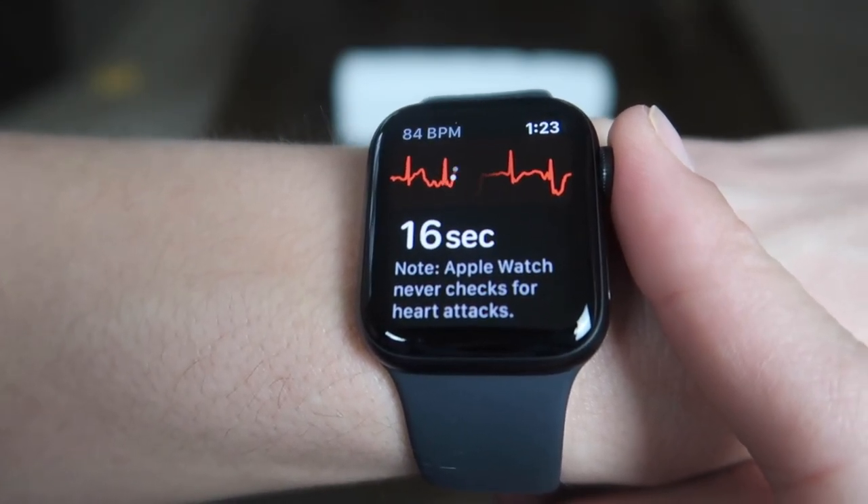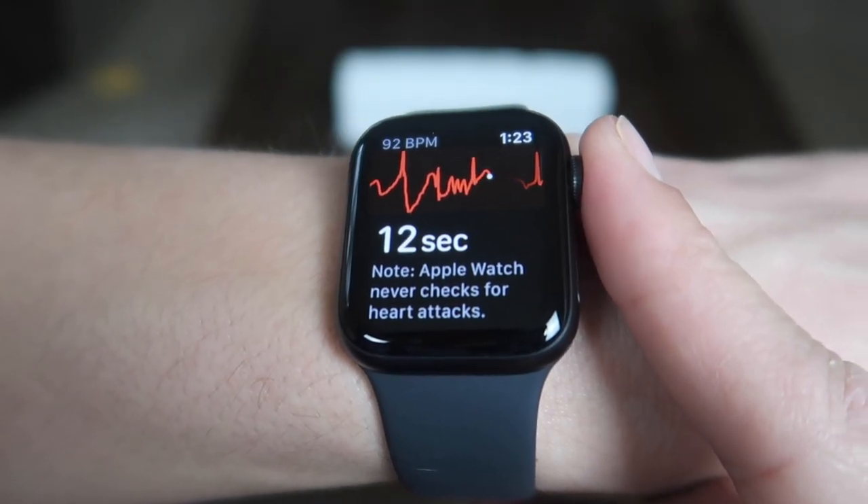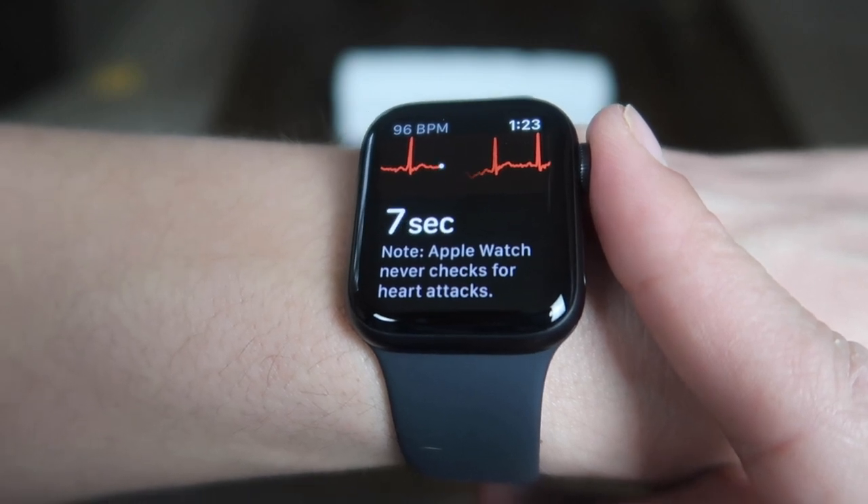It's kind of crazy that you can do this now on a watch. Hopefully I'm not having to go to the hospital. Try not to move your arms — okay, I'm trying to record a video here, Apple.